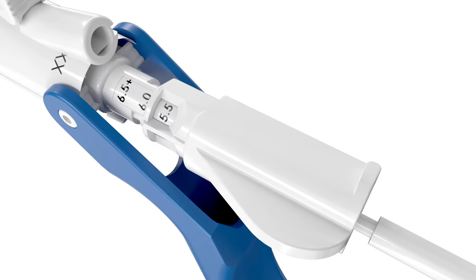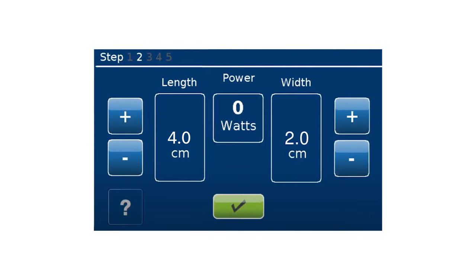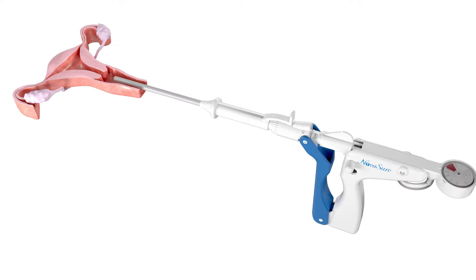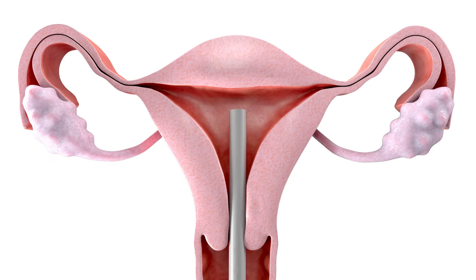Adjust and lock the NovaSure device to the appropriate length. Plug the NovaSure device into the RFC-10 generator and enter the cavity length into the control unit. After the dilation process is complete, start by maintaining slight traction on the tenaculum to minimize the angle of the uterus. Slide the cervical collar all the way back and, holding the front handle, insert the device transcervically in line with the axis of the uterus until the distal tip reaches the fundus.